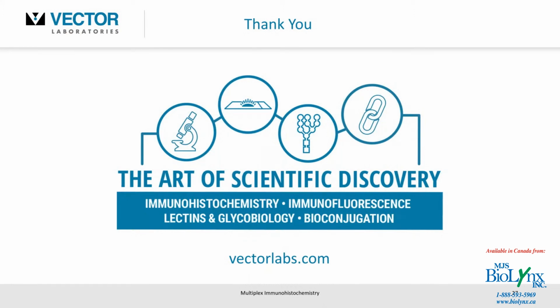Oh, absolutely, certainly, yes. Some investigators may have primary antibodies directly conjugated with an enzyme, as Byron mentioned there, either peroxidase-based or alkaline phosphatase. Sure, you could mix those two together. If one is, say, a mouse HRP and a rabbit alkaline phosphatase primary antibody, you could even mix those two together and then react the substrates separately after that.